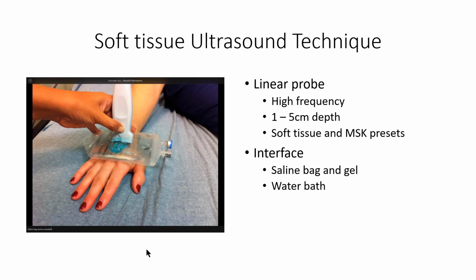If you don't have a little bag of saline, you can simply put the patient's hand in 6 inches of warm water, put the probe in there, and that also will provide a good interface for your musculoskeletal scans.